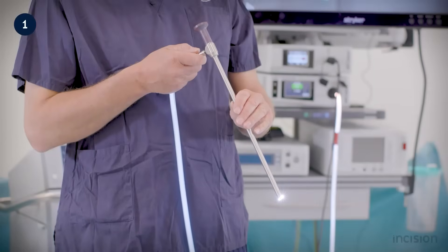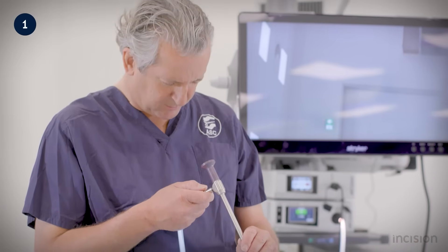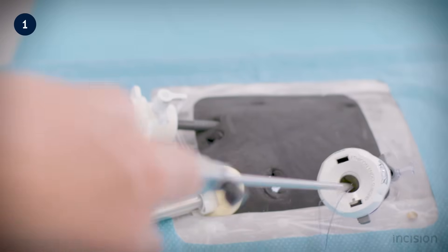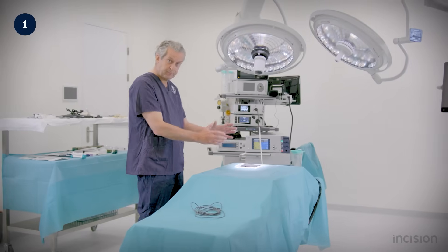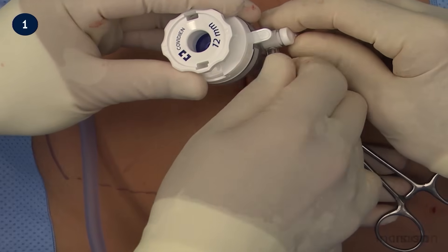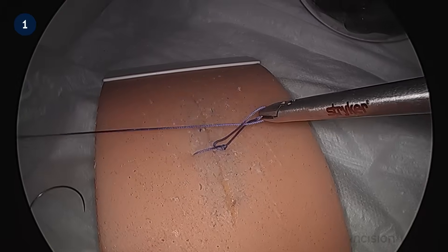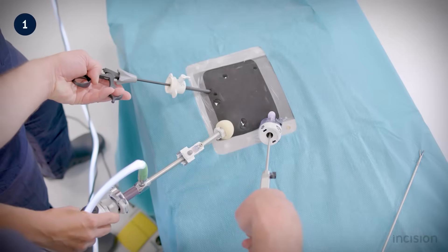This series of films gives a surgeon's perspective of some of the key elements of basic laparoscopic surgery, including description of some of the commonly encountered instruments and equipment, setup of a safe optimized working environment, abdominal access techniques and establishment of the pneumoperitoneum, and demonstration of some of the underlying principles and core competencies involved in the training of the modern laparoscopic surgeon.